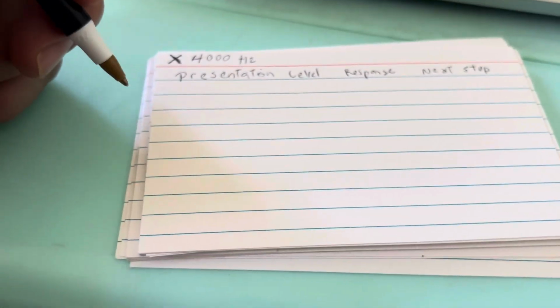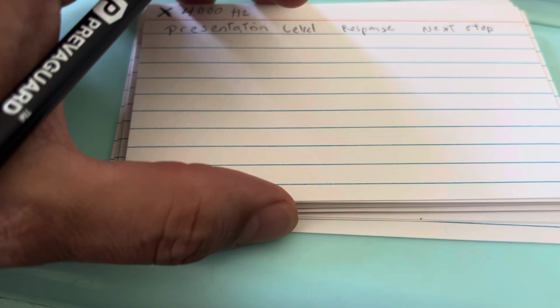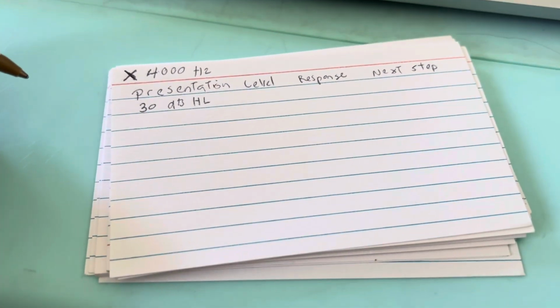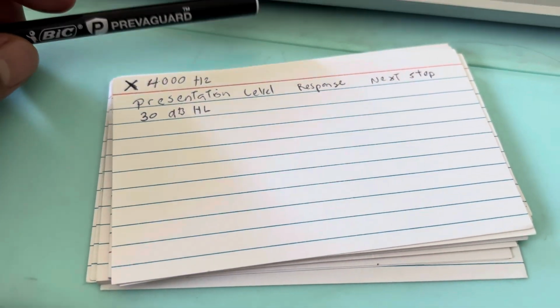Okay, so we always start, or they recommend you start, at 30 decibels hearing level for your first frequency test. So we're going to start.